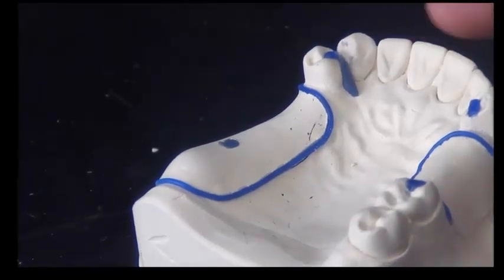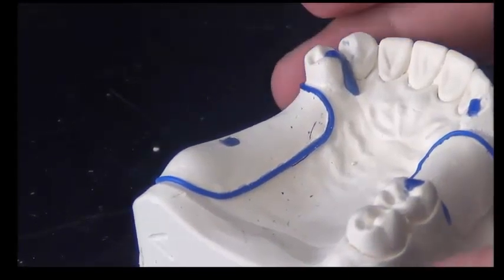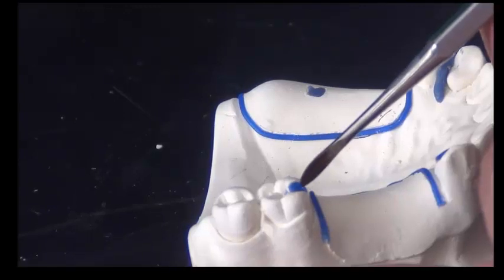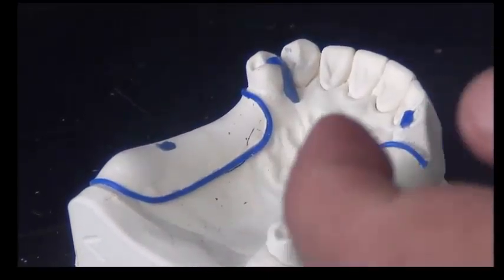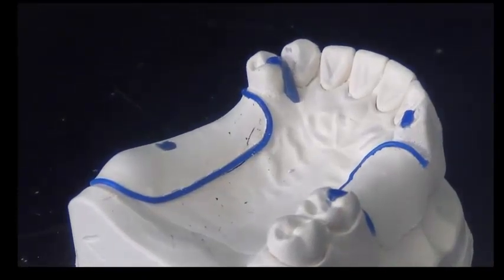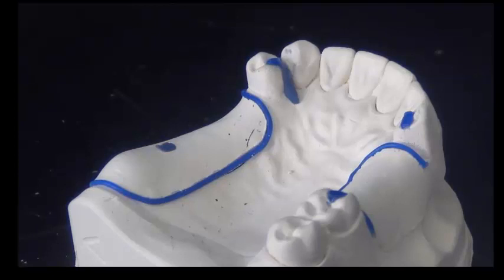Now these rests are close to the saddle area, and our minor connectors will be coming from the saddle area upwards, meeting these rests. So they are different from these single rests. Okay. So how do we add them? These minor connectors also serve another function, which is that they are guide plates. They are in touch with the surface of the tooth and provide us with guidance.